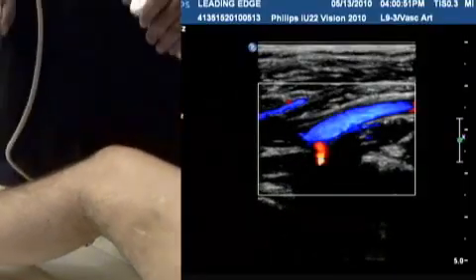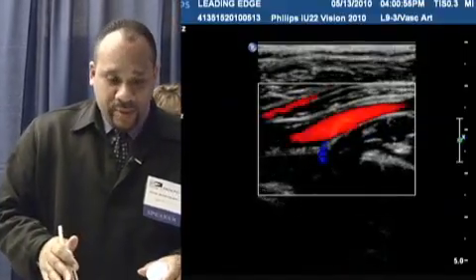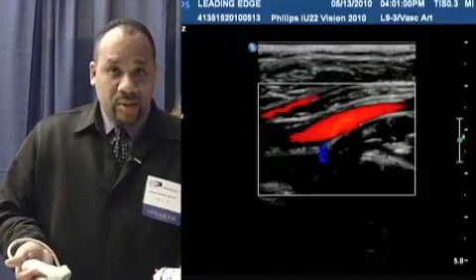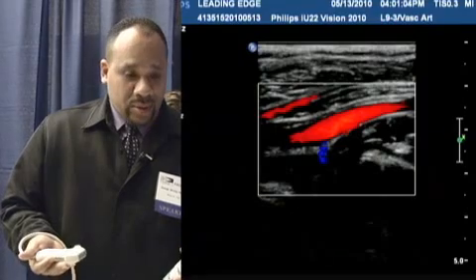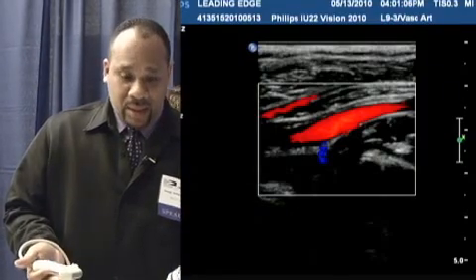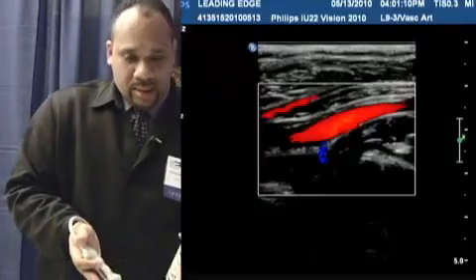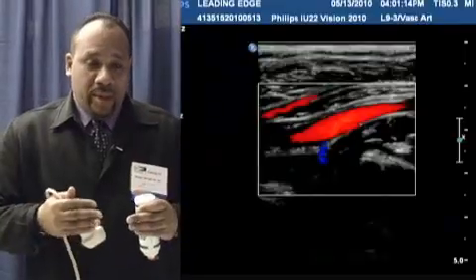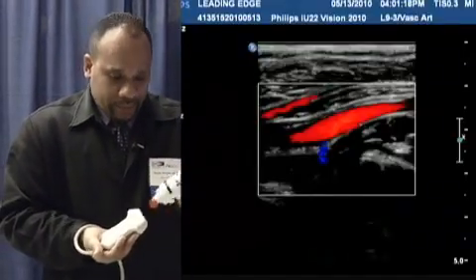But before we get to the tibial arteries, I do want to talk about what you would conventionally do in the thigh. In the presence of color flow changes that would suggest stenosis and/or occlusion, you should always go back and evaluate those stenoses in terms of elevations in velocity. If you do document occlusions, you want to both locate the occlusions and measure the length of those occlusions in preparation, or in anticipation, of drawing your arterial maps.